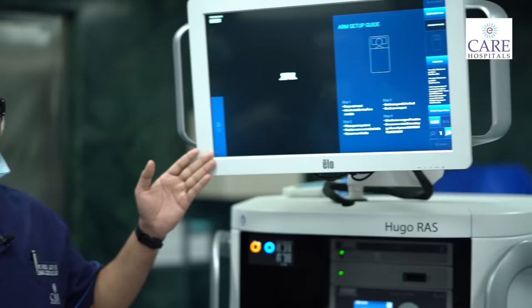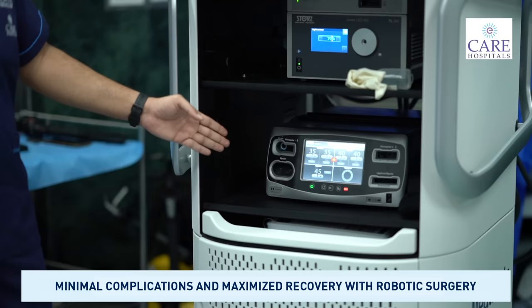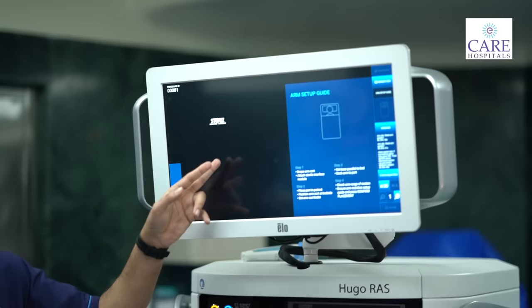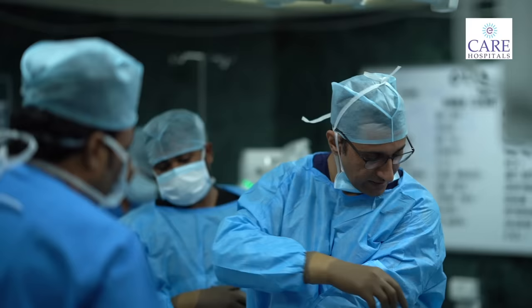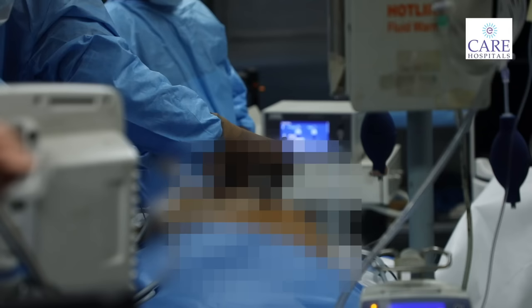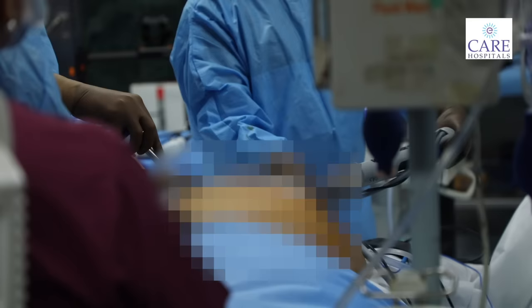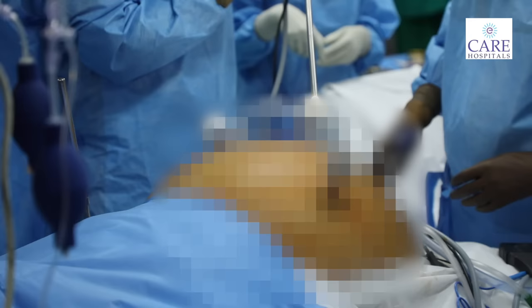This is the vision tower of the robotic system, the Hugo RAS system. It gives a nice 2D picture over here and 3D picture over the surgeon console. It is equipped with light source with the inbuilt Valleylab cautery and ForceTriad cautery. And whatever we attach, once the arm position is complete, you can see all the guidance. And if there is any mismatch or any error, it will be depicted here on the robotic system. This is how we put the regular ports, which are specially made for the robot, and we insert them manually. And once the ports are inserted, we dock them with the robot.